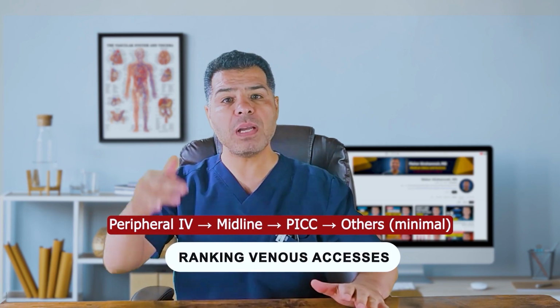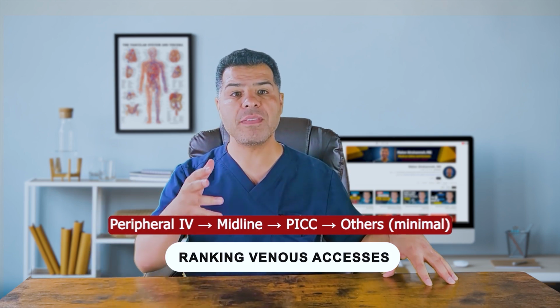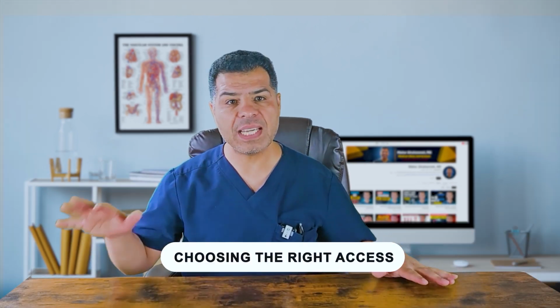How about by phlebitis risk or vein inflammation? This complication is most common with peripheral IVs, then midlines, then PICCs, and it's very rare with other central lines. How about choosing the right access?